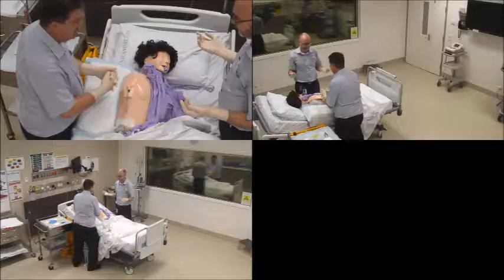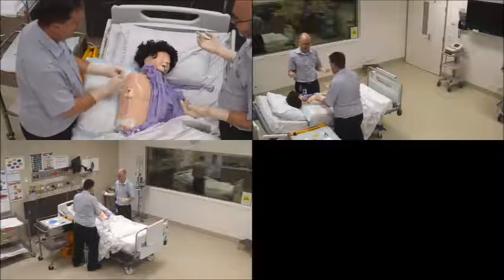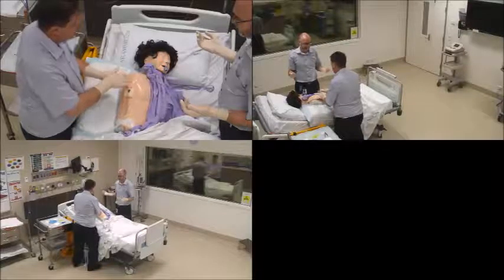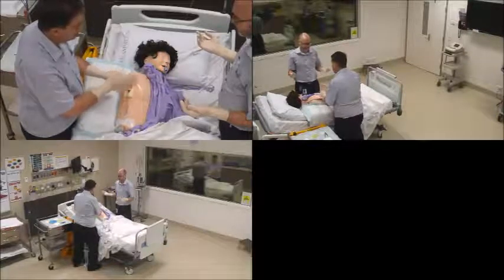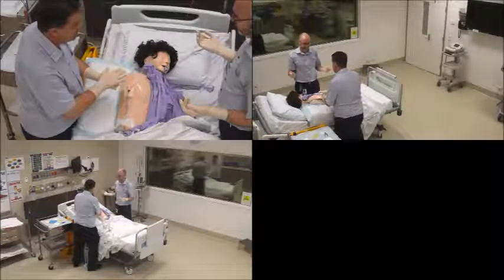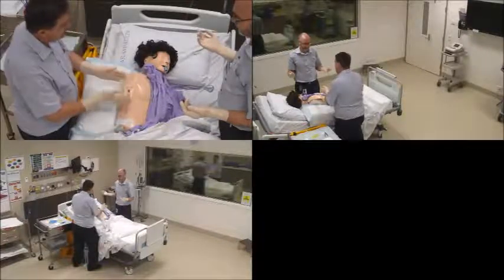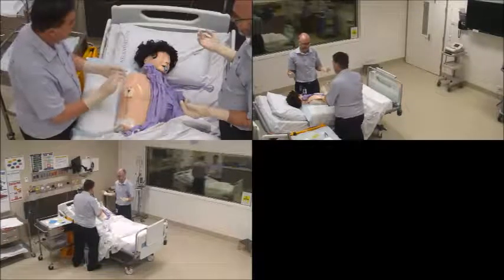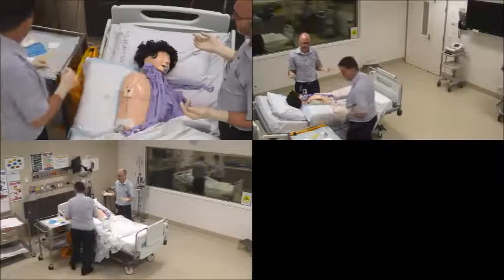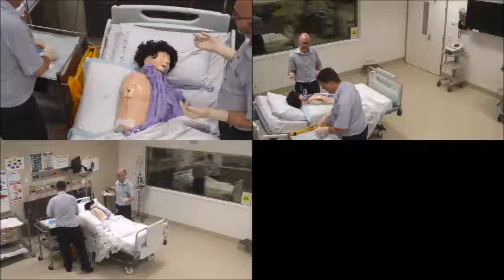Then breathe in. Breathe out. Take a really deep breath in, and then hold it. Now while you're holding your breath, I'm going to cut the suture, take the tube out. Kim's going to put the Steri-Strips and the dressing on over the top, and once that's completed, I'll say breathe normally, and you can breathe normally. Okay? Now the length of time that you've just held your breath for is about the length of time that the whole process should take. Okay? Have you got any questions? No? Okay. So I'll just give this a quick dry off.